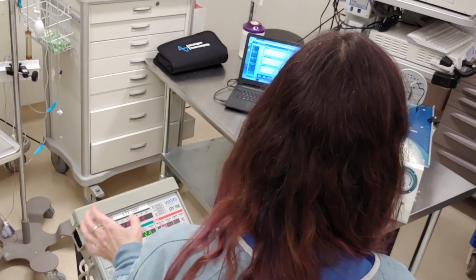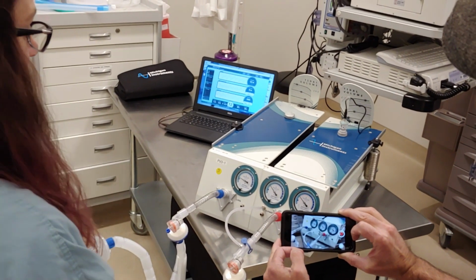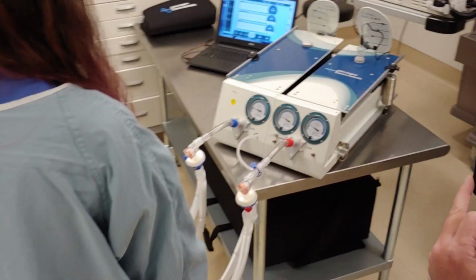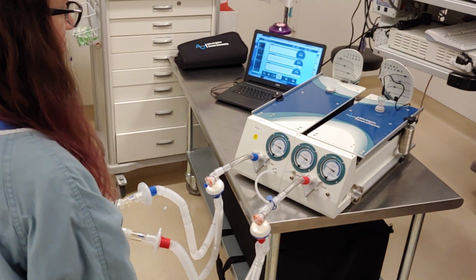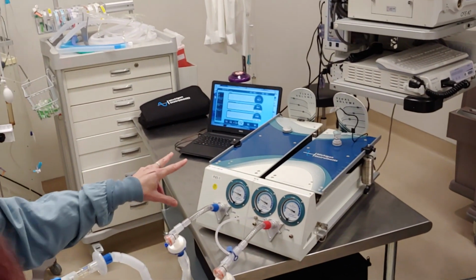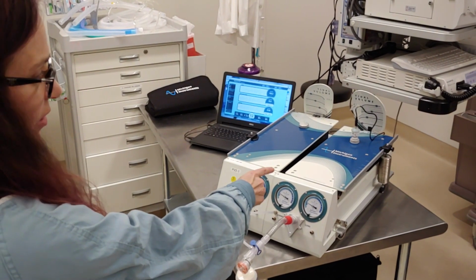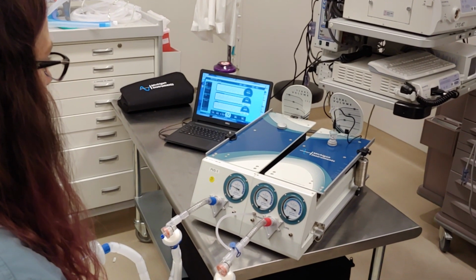40. Let's keep up a little bit. Now this patient's getting 38 over 8. This patient is getting 14 over 5. As you can see, the tidal volumes are still different, but now we're getting bigger tidal volumes on the sicker patient and reasonable tidal volumes on the more compliant patient.